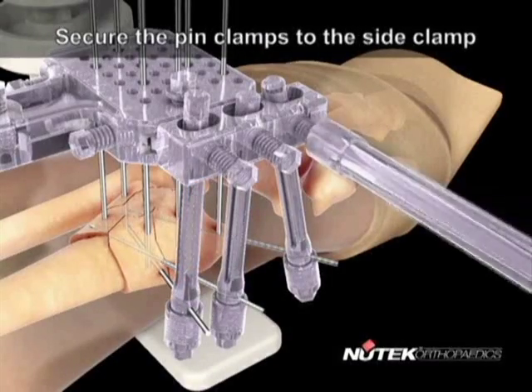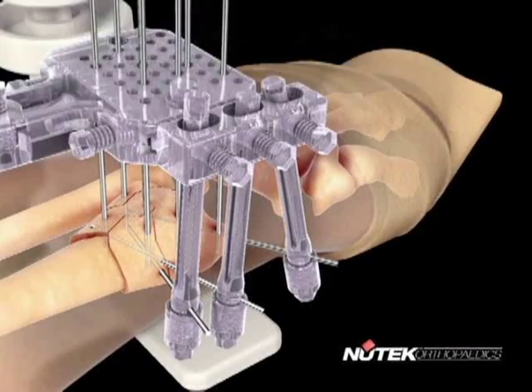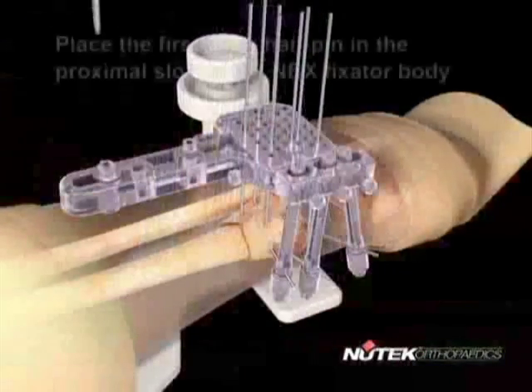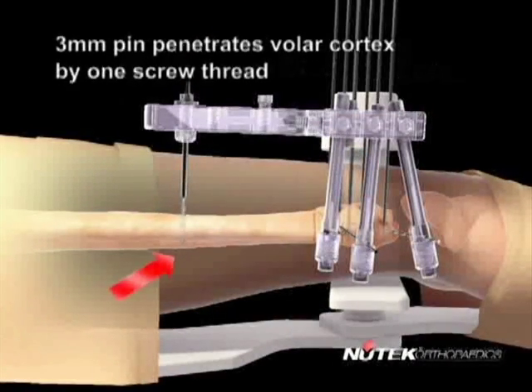Secure the pin clamps to the side clamp. Secure the side clamp to the NBX fixator body. Place the first 3 mm half pin in the proximal slot on the NBX fixator body. The 3 mm pin penetrates the volar cortex by 1 screw thread.